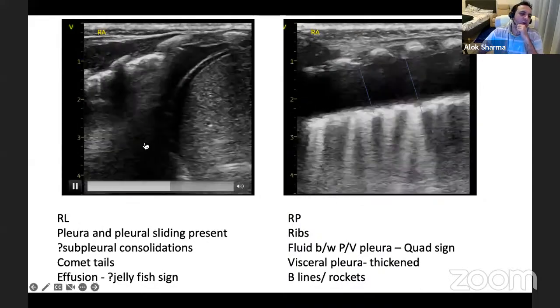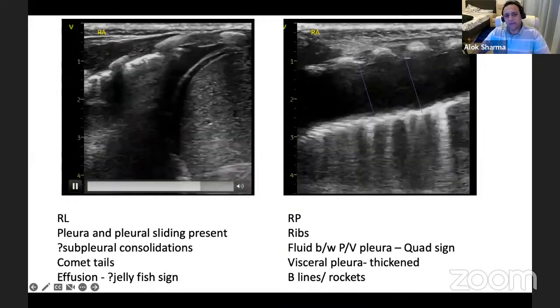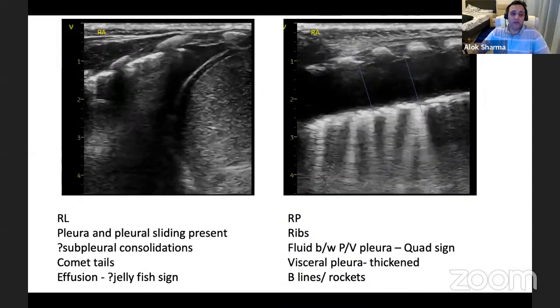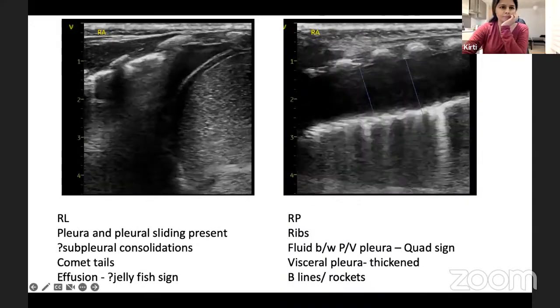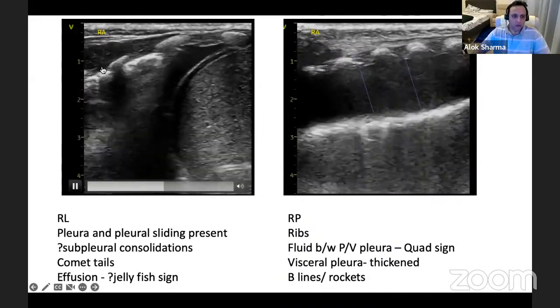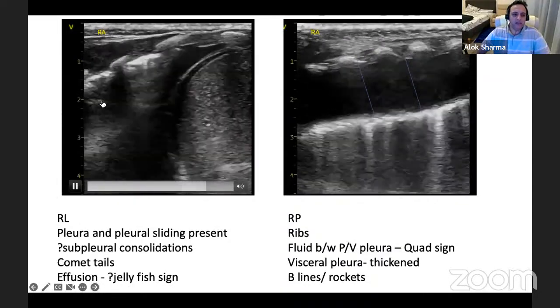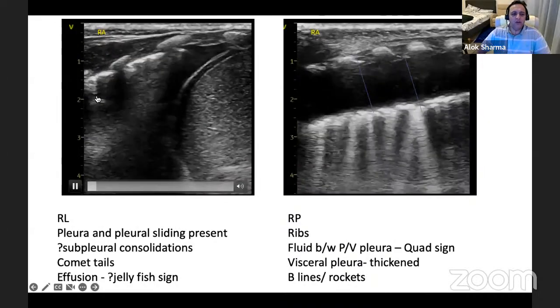And really what you've got over here, so if you take your arrow and move to the extreme left of your screen. Yep. So if you go to the image, just go further down. There's a line that goes all the way down. That's a B line. Okay. That's a very nice discrete B line. And below that B line, what do you think this is?